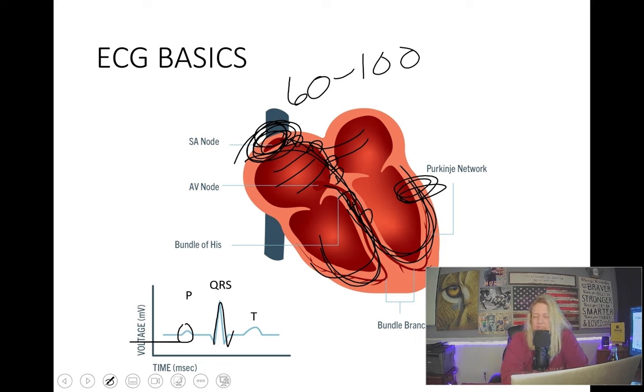Okay, let's look at another one. All right, let's look at this one. Again, I'm going to find one that starts on a line, and these are a little bit less obvious. They don't have this sharp edge. So I'm just going to go with this one. This one looks like it's starting on a line.